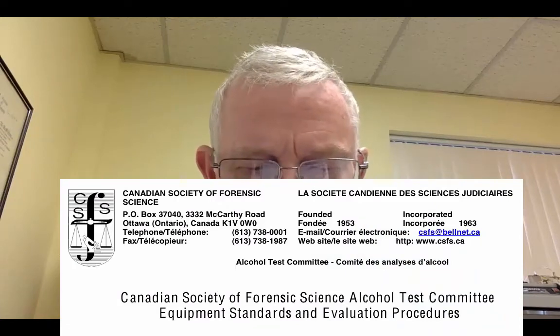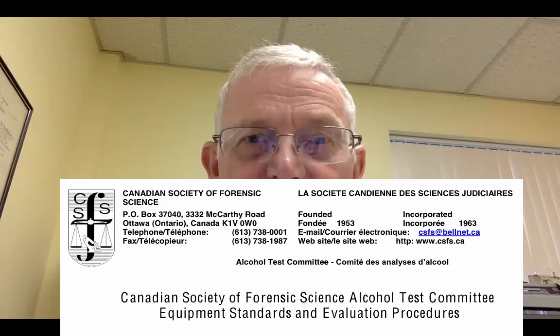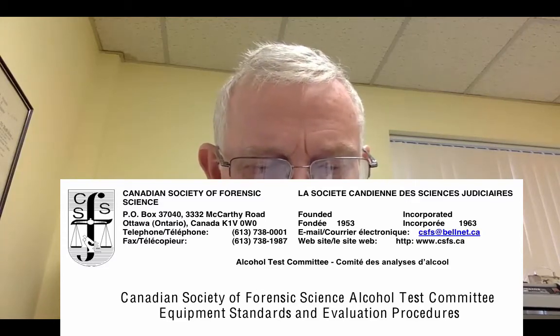And isn't it true that the evaluator had the assurance when they started the evaluation that they would be using the recommended standards of the Alcohol Test Committee with respect to evaluations of the new instrument, and the evaluator would check the calibration of the instrument at a variety of different values, probably something like 50, 100, 150, 300. So the evaluator would check the calibration of the instrument.